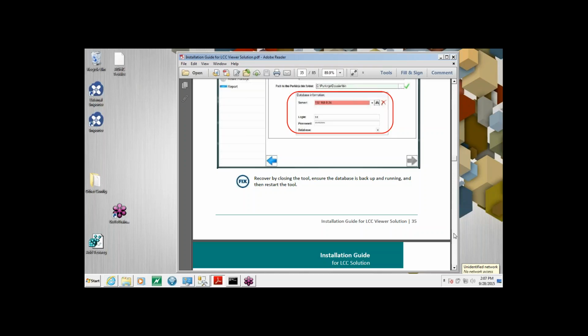Using MySQL, the community edition of MySQL is free and doesn't have any database limit, therefore you can use it. However, MySQL is a little bit more complex on the administrative side. There is no automatic backup available directly out of MySQL. You can schedule a dump.